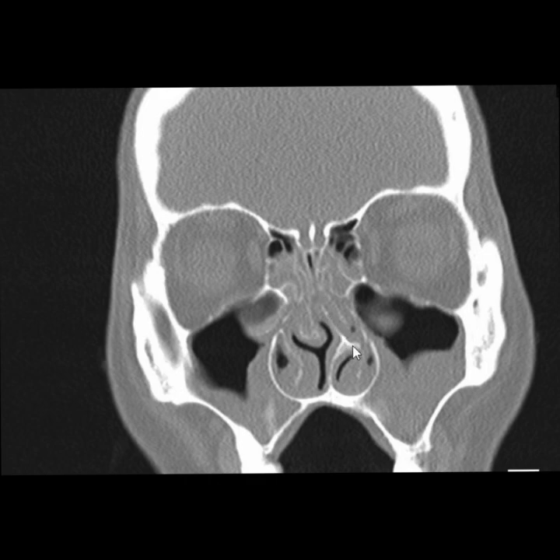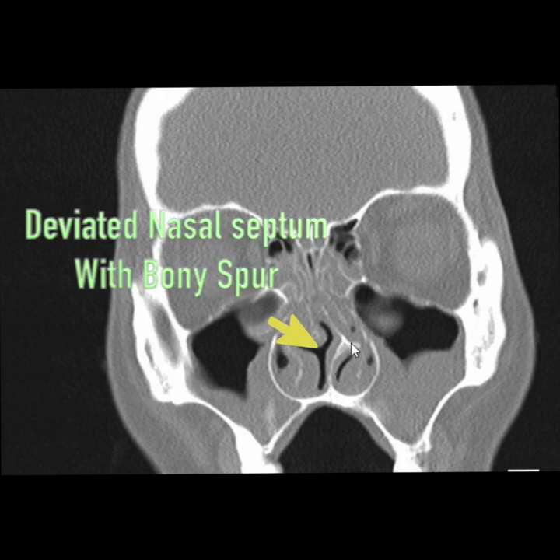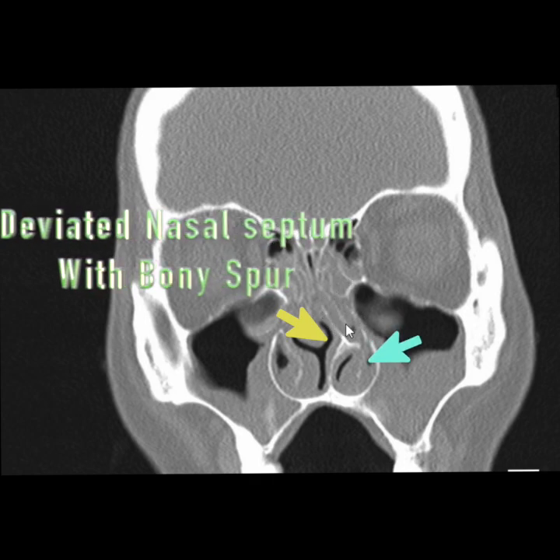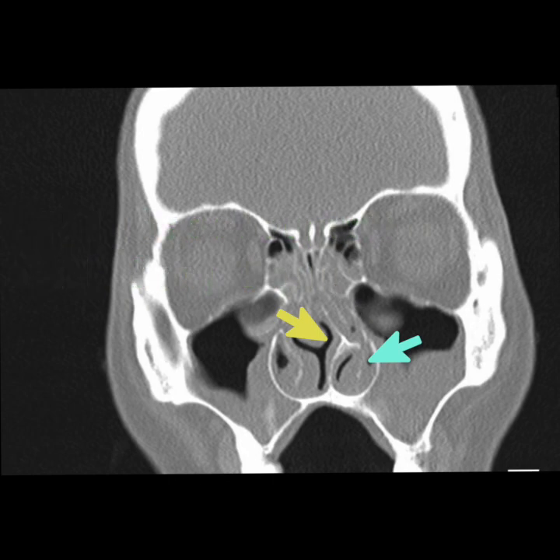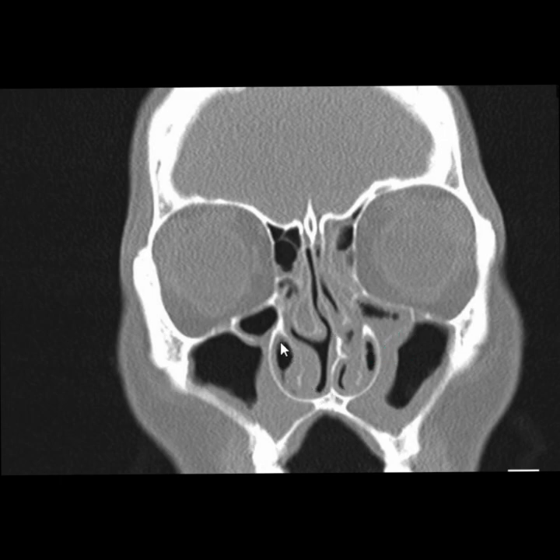This is another important finding: a massive deviated nasal septum with a large bony spur impinging on the inferior turbinate. This has caused a lot of crowding over here. Moving a couple of sections back, there's also a Haller cell — so obviously the ostiomeatal complex will get blocked on the left side. On the right side, there is no deviation, but there was enough space and the inferior turbinate has grown — so there is unilateral enlargement of the inferior turbinate.